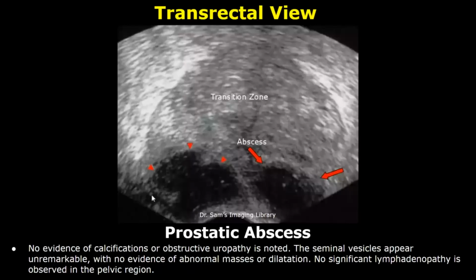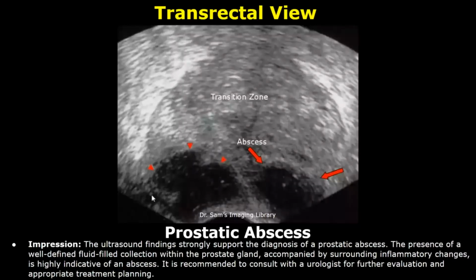You can write the findings of the prostatic abscess in the impression, and in the end you can advise consultation with a urologist for further evaluation and appropriate treatment planning.